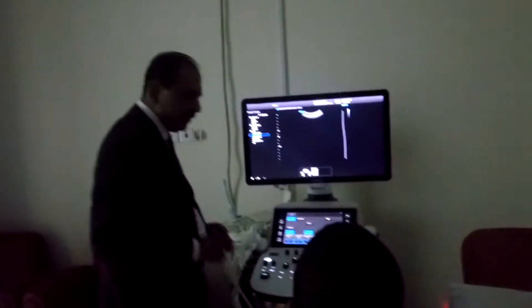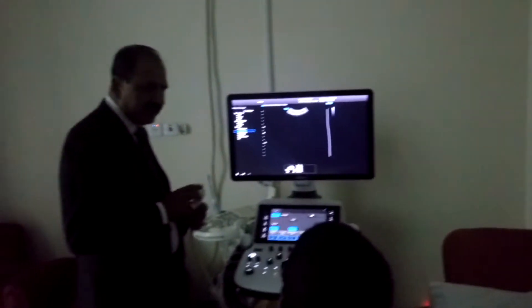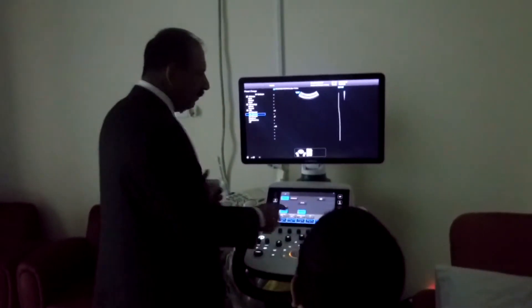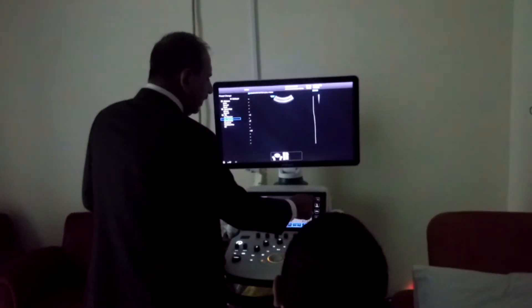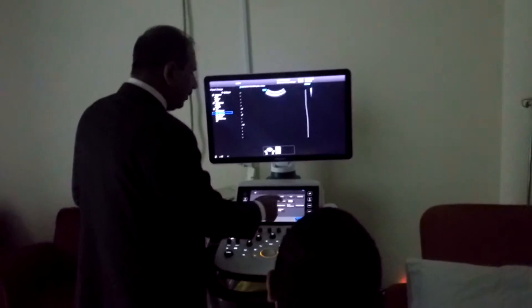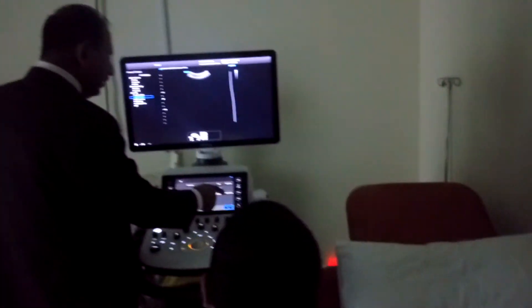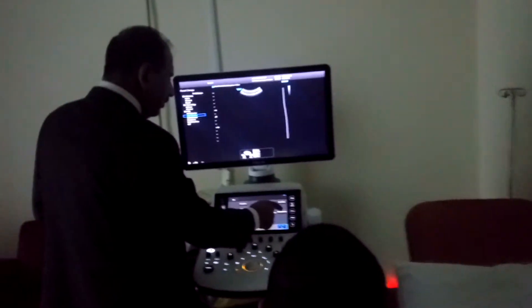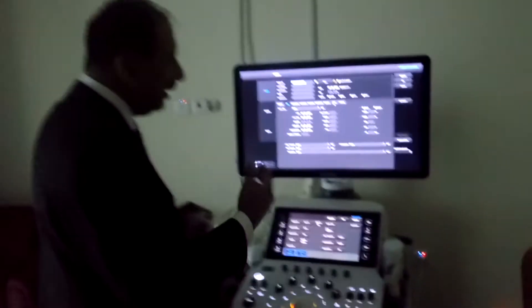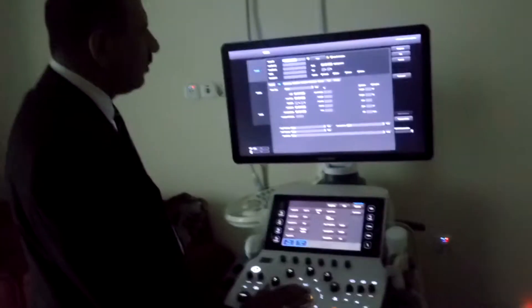S-detect, smart detect. So this demo, I would like to start from the demo. S-detect, ok. Then we can start practically outside.